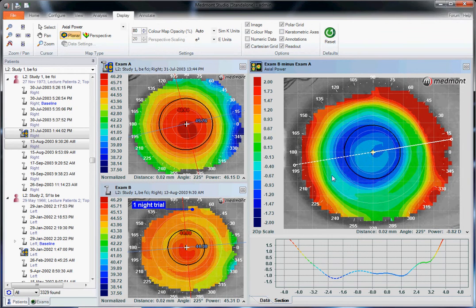We look at the blue area of treatment and determine where it is in relationship with the pupil. In this case, we can see the green-blue border appears to be vertically well-centered but slightly temporal. When we refer to the baseline map, we see the green-yellow border of the baseline map seems to be pulled a little bit temporal on this right eye and a little bit inferior. And that's where our treatment zone appears to be decentered as well. So this lens is likely following the natural displacement of the eye.